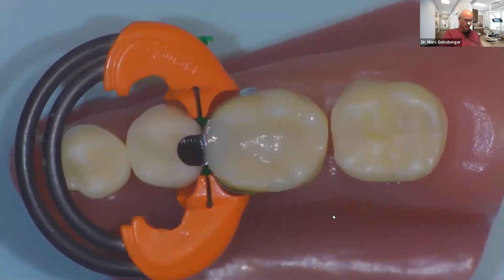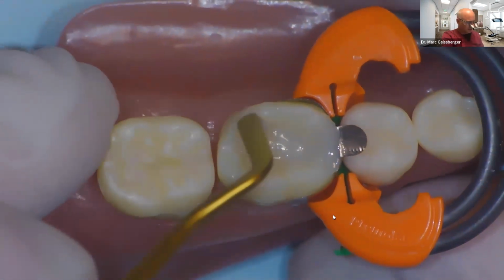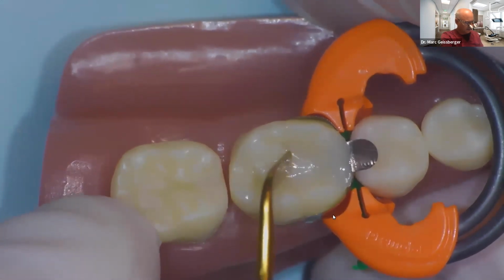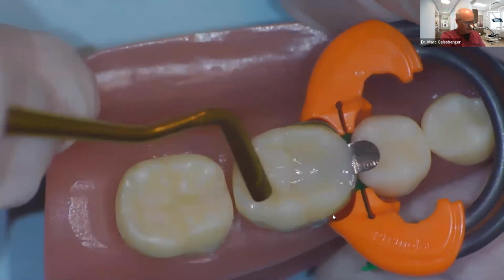I'm going to start with my occlusal anatomy. Now this is really cool. You can do it in many different ways. This is where I told you I'd be flipping this around. But I'm going to start with one of my lingual triangular ridges. And I actually build my triangular ridges in really 4 or 5 steps, depending on the anatomy of the tooth.